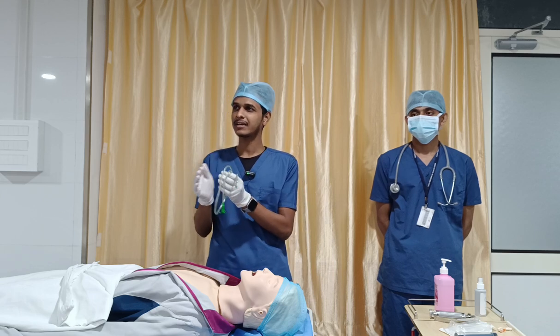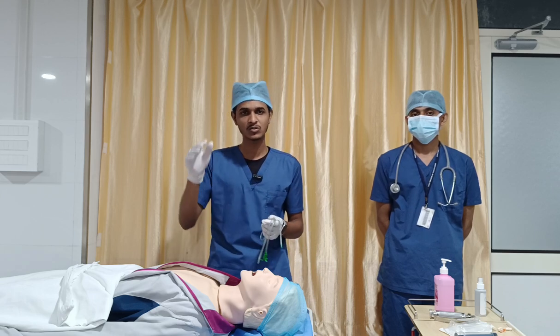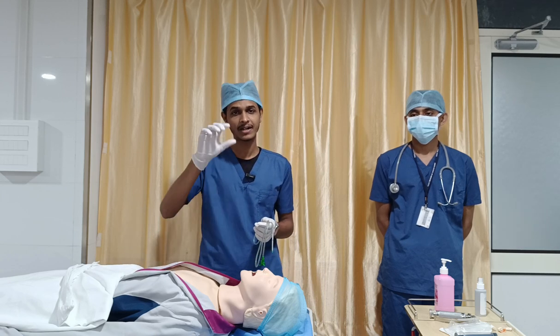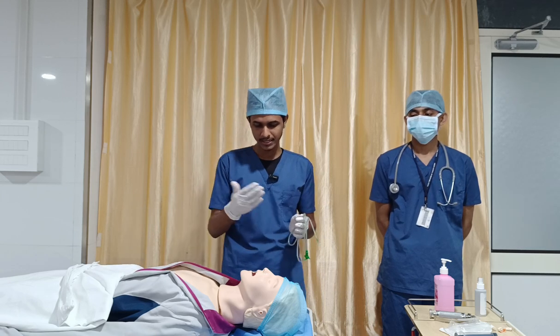Almost 98-99% succeeded, so the catheter was placed exactly in the epigastric region or the fundus region, which is our ideal location. So that is what I read.